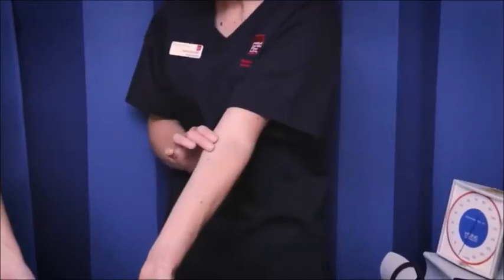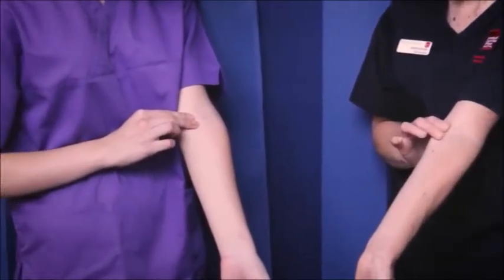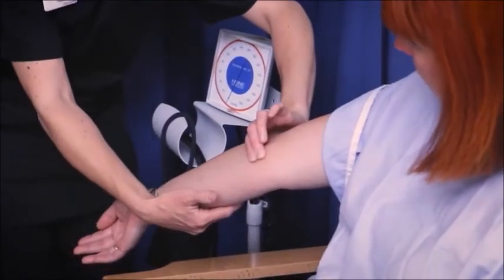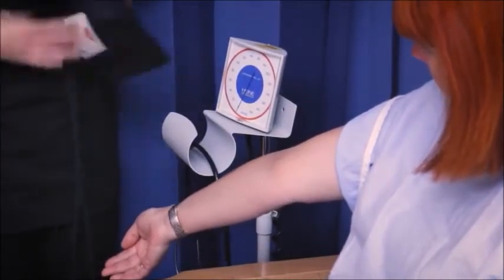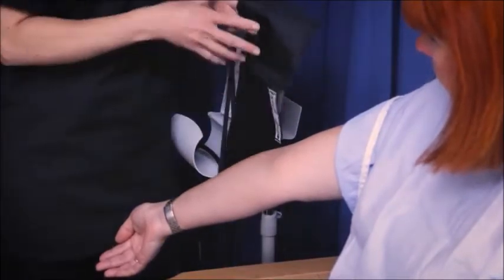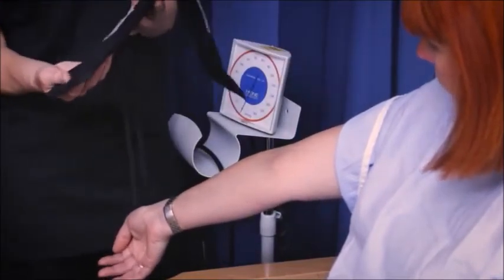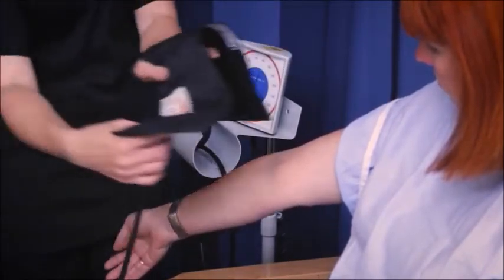You can try and palpate your own brachial artery. You can find a nice round brachial pulse there. So I'm going to place the cuff on the arm. You need to make sure that the cuff is an appropriate size for the patient, a few centimeters above that, because that's where I'm going to need to put the cuff over. If you notice on the cuff, there's a little arrow saying artery, and that's where you place it.